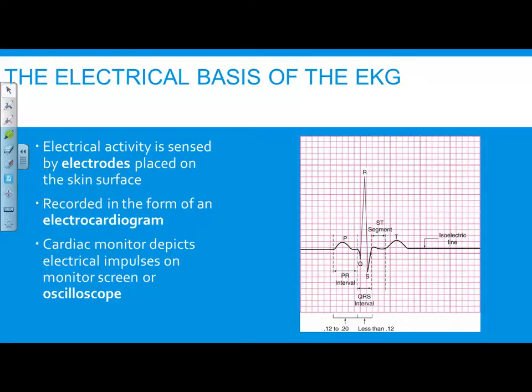The screen on the electrocardiogram, although it is now digital, is called an oscilloscope. Oscilloscope.